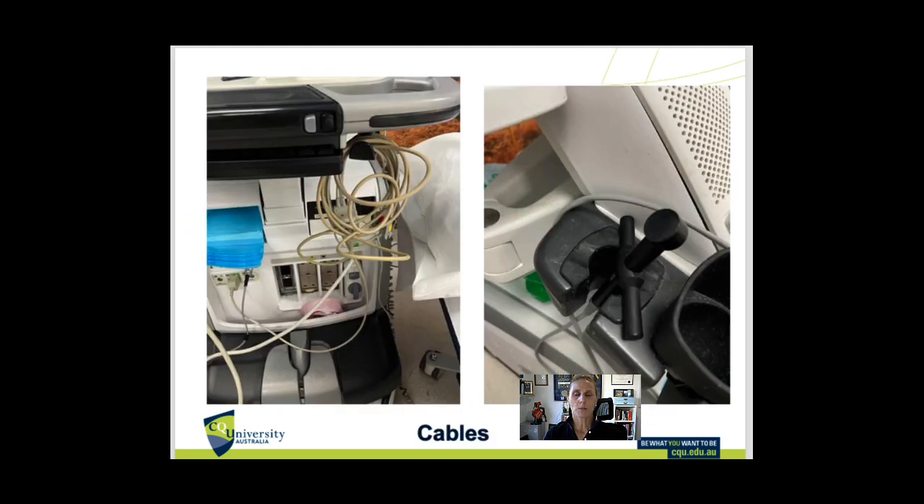With our cables, we still want to clean these, but they also have a rubber casing and we want to make sure that doesn't erode and expose wires. So again, a soft cloth to get any gel off and then a non-alcoholic disinfectant wipe or that spray is good for the cables as well.